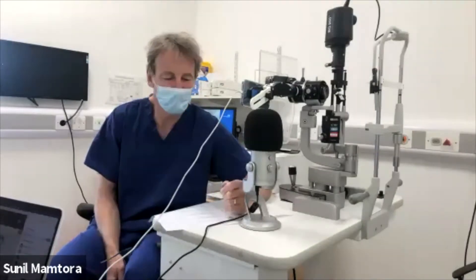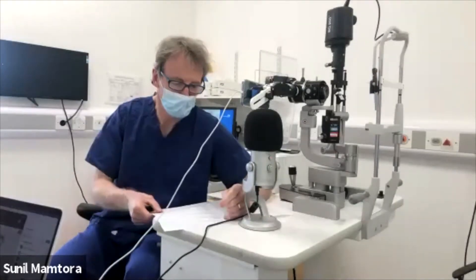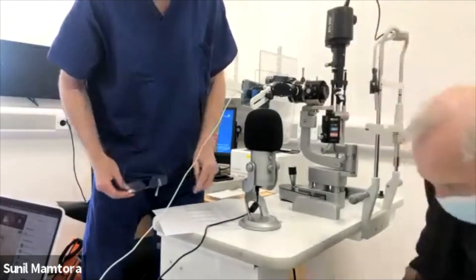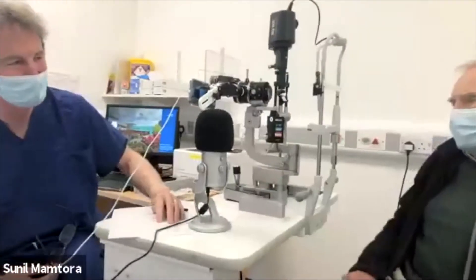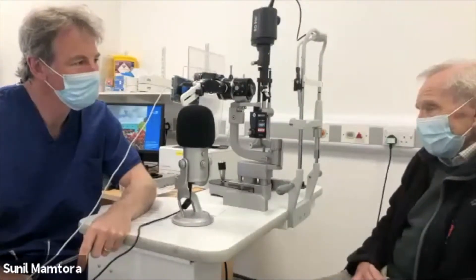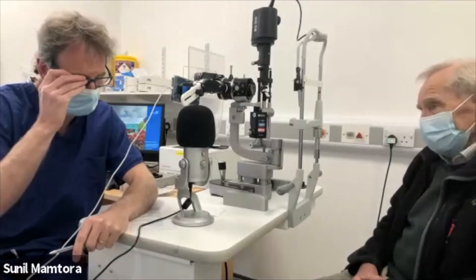Our first gentleman is an 88-year-old chap with left-sided ptosis. Thank you very much for giving up your time this afternoon to come along. The patient describes sensitivity to sunlight and bright electric light.